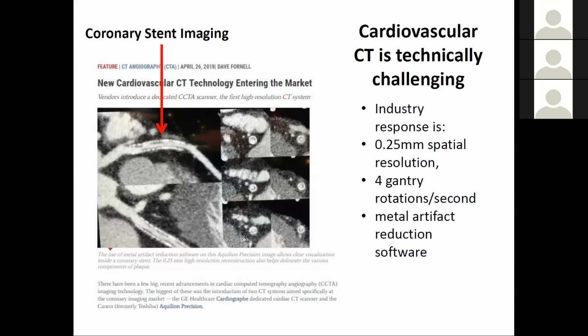Okay, so when that's no longer the case, you've given it something to do an inverse radon transform on that was never a radon transform. So it responds by giving you a streak. So there's no such analytic solution. Whereas the model-based approach can improve on it, but at the cost of a lot of handwork, and working differently from one time to the next if you're not careful.